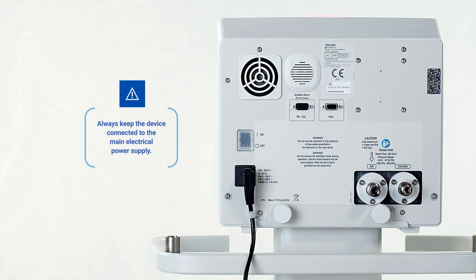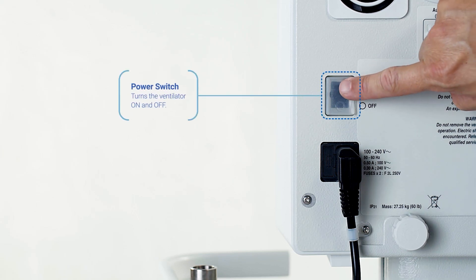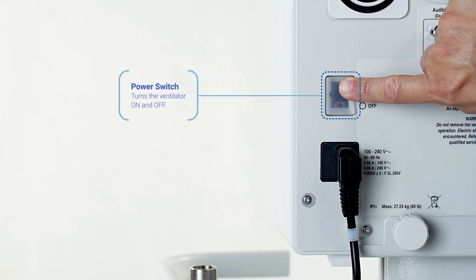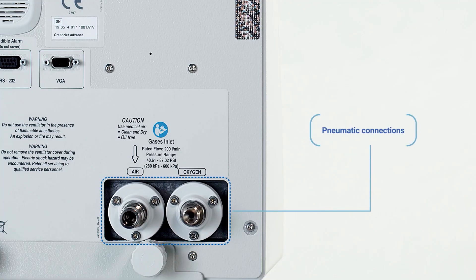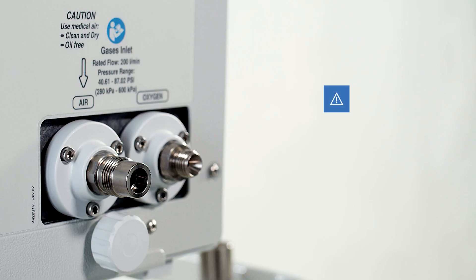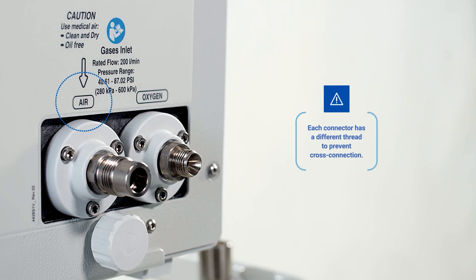Above the electrical socket is the power switch to turn the ventilator on and off. The pneumatic connections can be found on the lower right side: one connector for air and the other for oxygen, both properly identified.